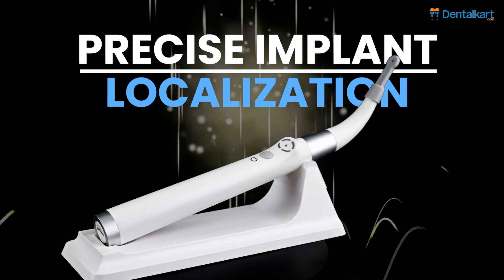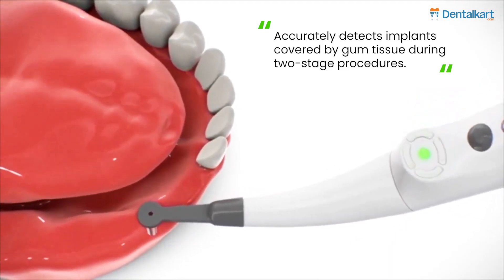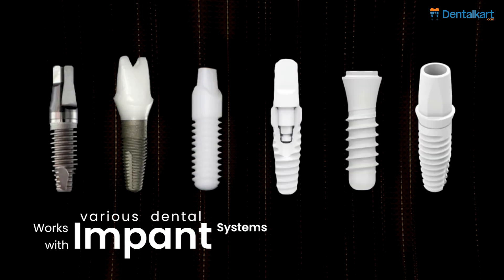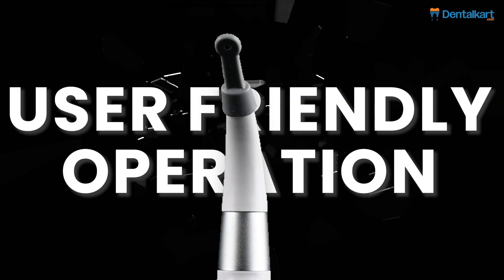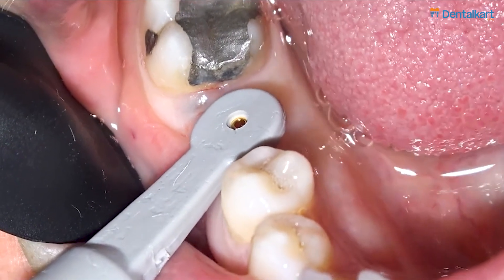Precise implant localization: this feature accurately detects implants covered by gum tissue during two-stage procedures. Wide compatibility: works with various dental implant systems for versatile use. User-friendly operation: designed for easy use by qualified dental professionals in clinical settings.